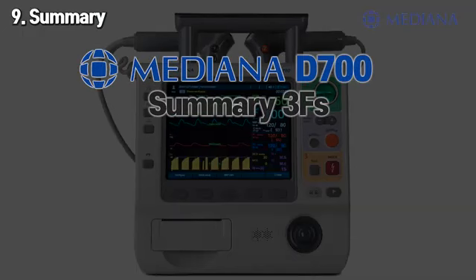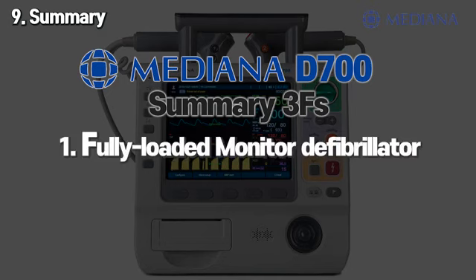We can summarize D700 by three key points. We call it the 3 Fs: fully loaded monitor defibrillator, friendly user interface, and for anywhere. As a fully loaded monitor defibrillator, it has all the functions that it needs. It uses advanced biphasic technology which can deliver up to 360 joules. It has an all-in-one defibrillation mode including manual, AED, pacing, monitor, synchronized cardioversion, and internal defibrillation. For 12-lead ECG monitoring, we use the Glasgow algorithm.